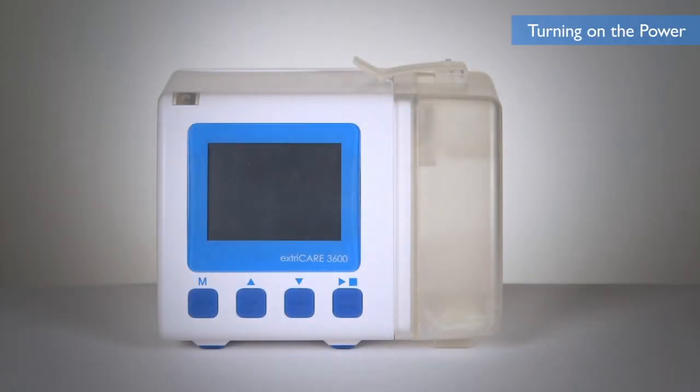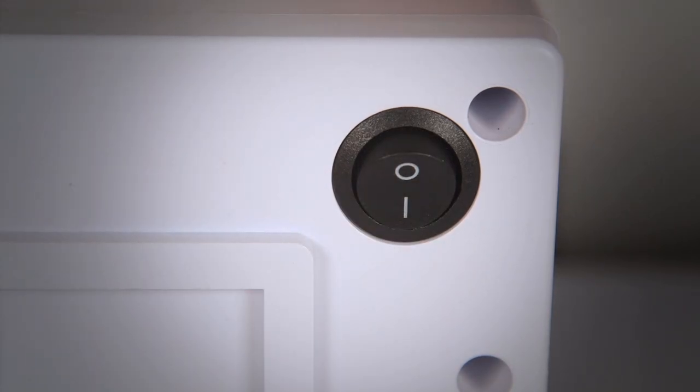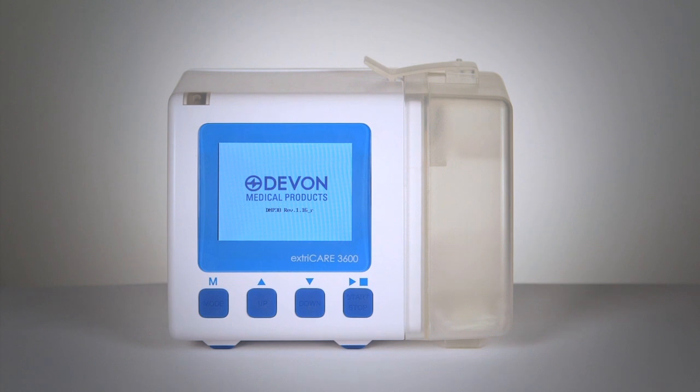To turn on the ExtraCare 3600 pump, flip the power switch located on the back panel of the device. The screen will display the starting image and the system will complete a self-check. After the self-check, the device will display the standby screen.